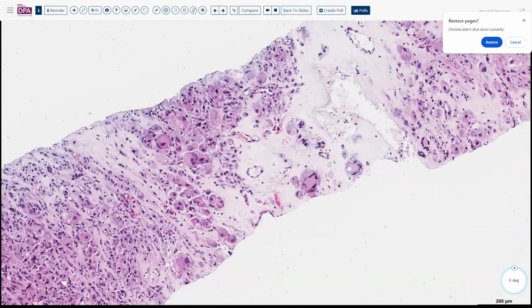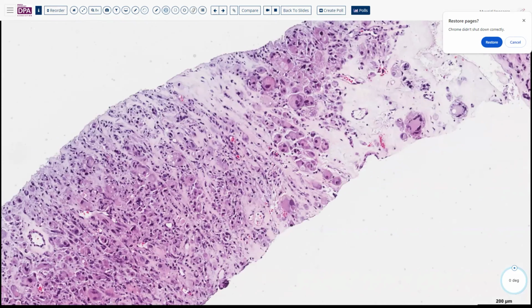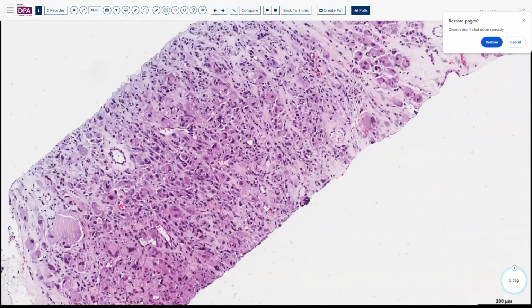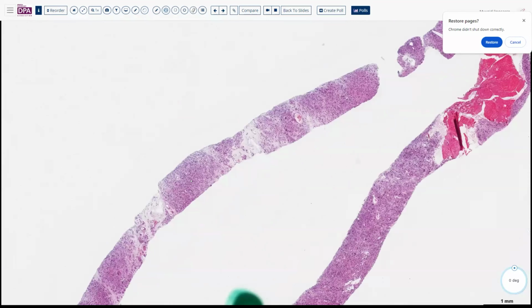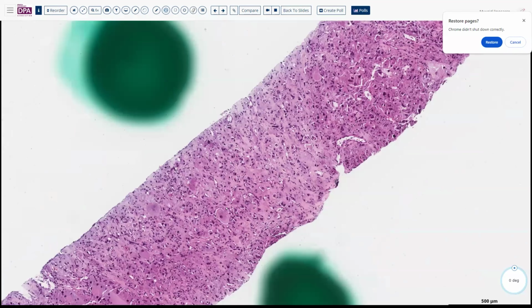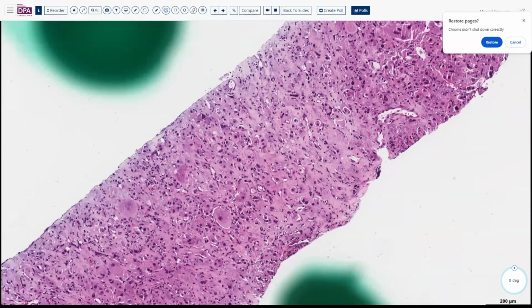So I think that's the lesson: sometimes going to high magnification and looking for features like this or this in rare single cells can give you a few clues. And I don't know if my partner did that in evaluating this tumor, but I found that a very instructive feature to learn from this case, to look at some of the single cells, to look for some of those subtle clues like very gentle vacuolization, as we see in a few fields here.